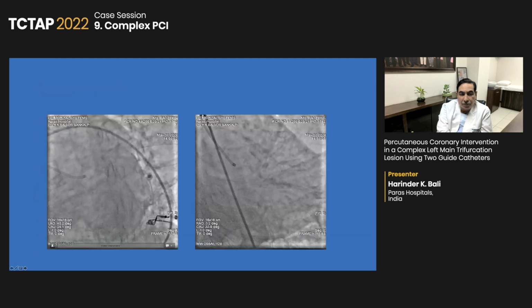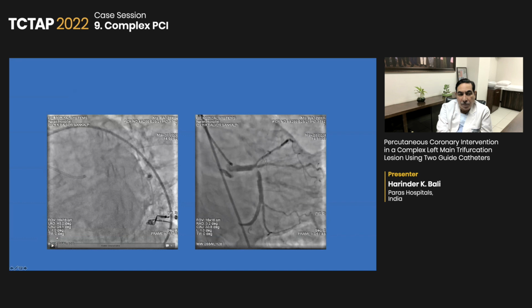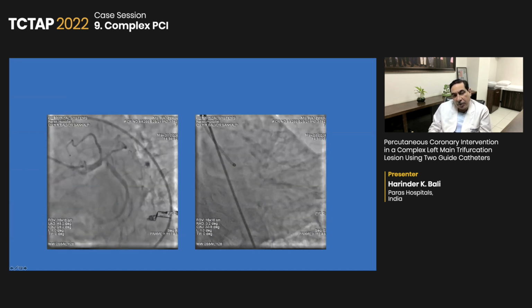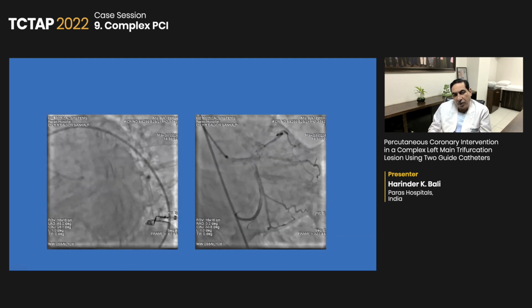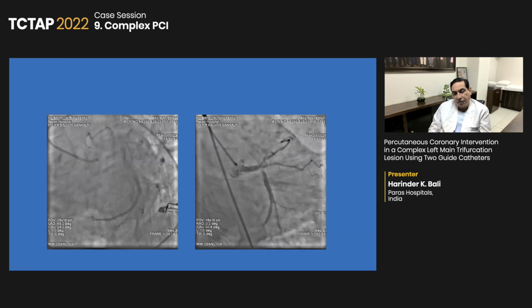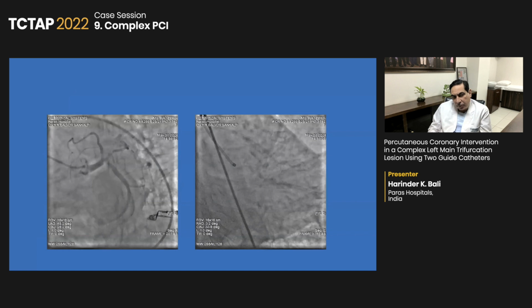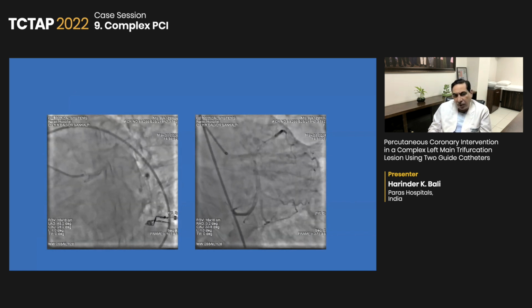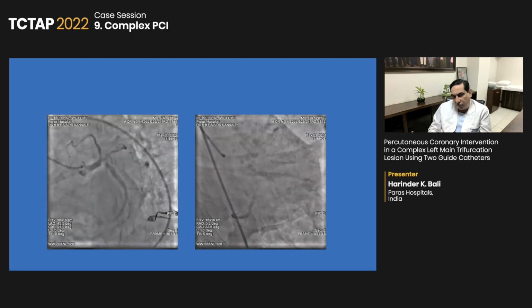Now this is the angiogram, and we can see the left coronary system, the distal left main disease. The circumflex is dominant, with a critically narrow calcified lesion. The ramus has some insignificant disease at the ostium. The LAD has an ostial disease of about 40 to 50%.